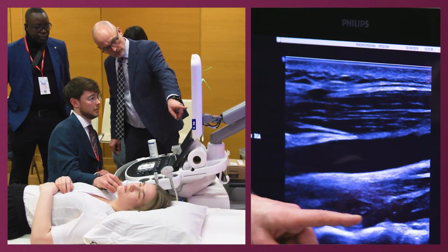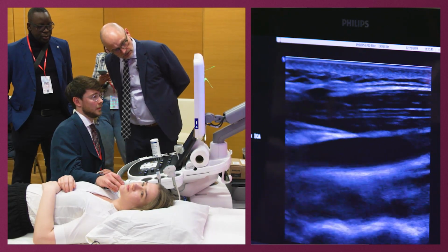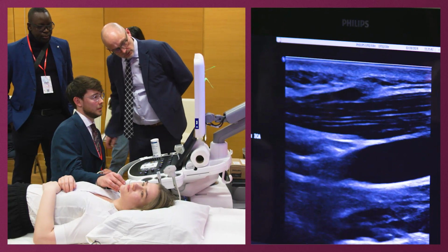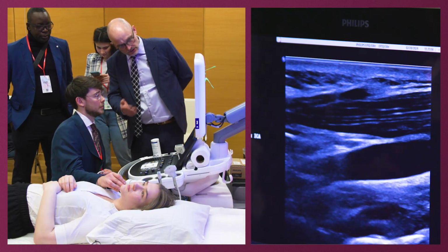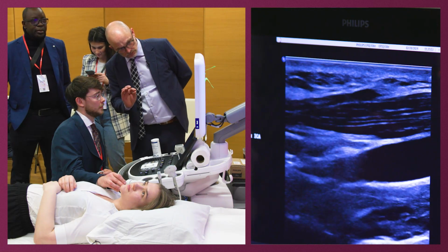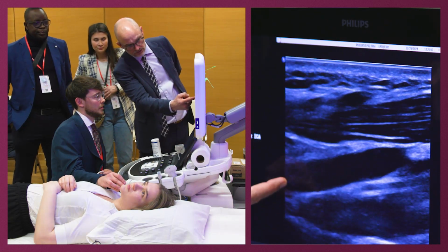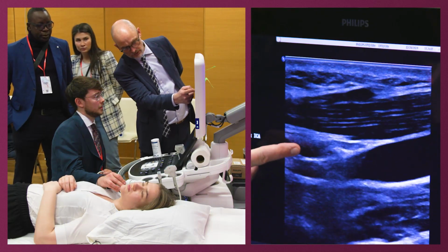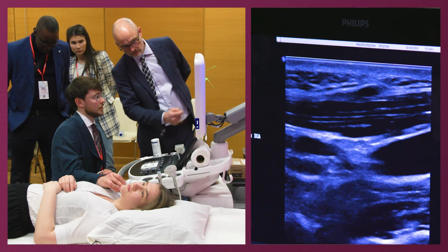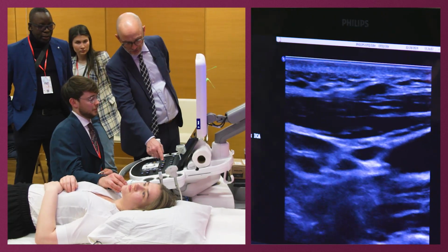So you have the vertebra here. Yeah. Common carotid. And try to go from one side to another side. Don't look at the patient. Yep. Look at the screen. Small movements. Yes. Here you have one vessel, I guess. And then you have another. And you have another one up here. Yes. That's not difficult. Then put on the collar.